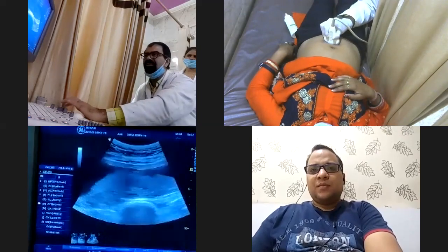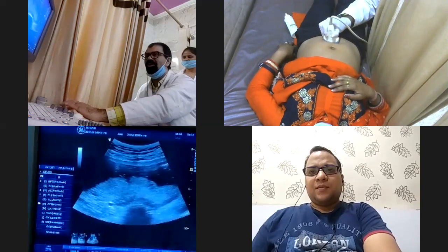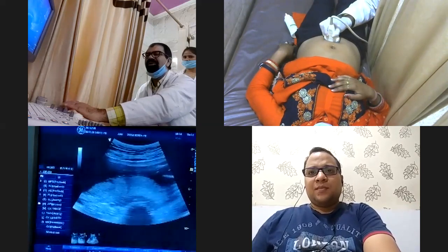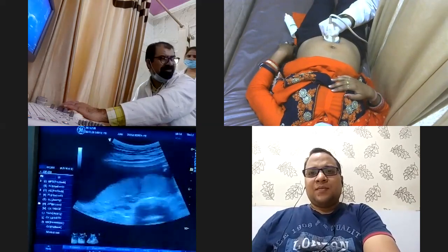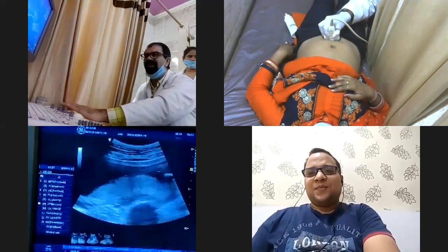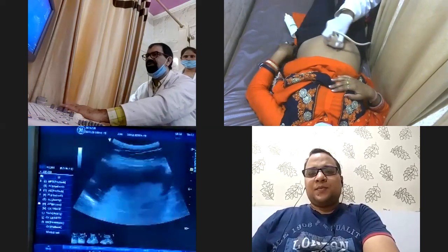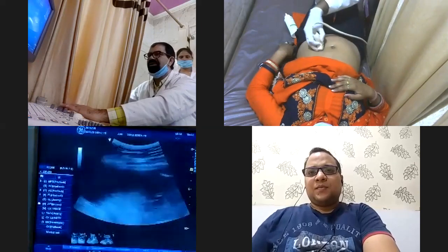Now see, I am giving myself a challenge, because now I am dealing with a person who has never seen the fetal ultrasound. Am I right, Doctor? Yes, sir. Now let me freeze this image. I will get back to this. First of all, let me show you the transverse and longitudinal sections.